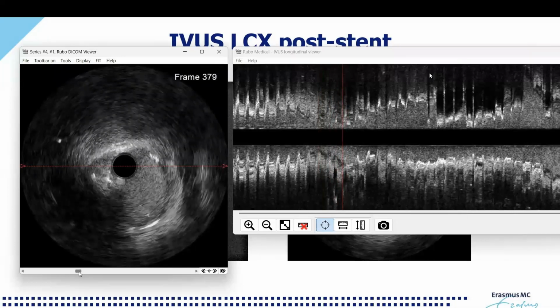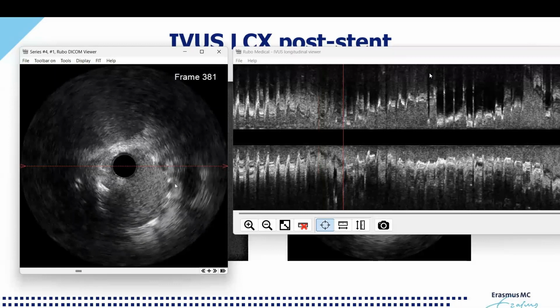The stent in here. Here you see the stent, you recognize it by the spots in there. Now, what we need to do first, there are three important things for that. I always call the minimal luminal area in the stent, and that tells you something about deployment. I always look at apposition in there, but also we look just outside the stent for the plaque burden, and we want to have this plaque burden less than 50% outside. Maybe we can start with that. Let's do it in here.